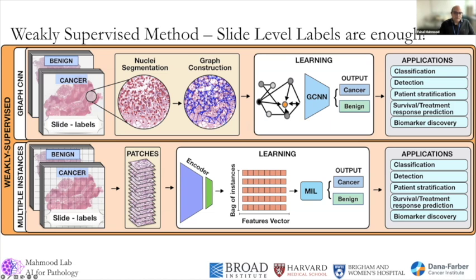The other approach is to use something called multiple instance learning, which assumes that this large slide is a bag of smaller, tiny patches, and we can represent each patch as a lower dimensional representation. And this encoder could be trained on just using real world images, or it could be something that's slightly more fancy, like a self-supervised encoder, but encoding these patches into a lower dimensional representation and learning from those. This, as I said, enables us to solve a lot of problems that are large scale, yet using data and information that is already collected for clinical purposes.